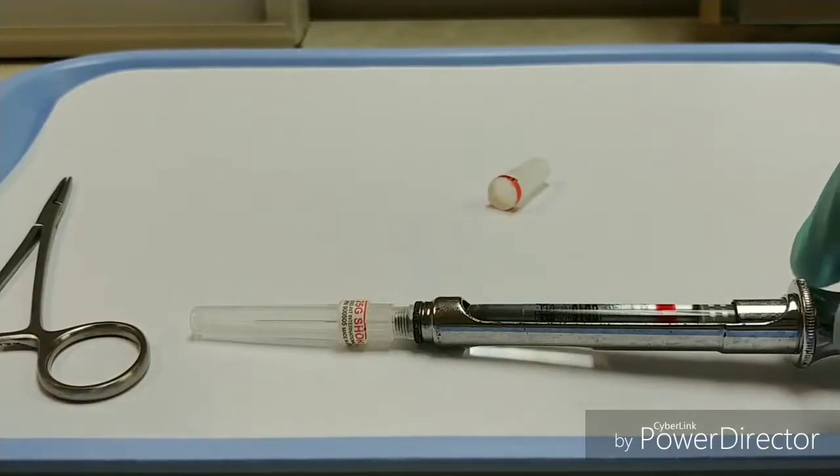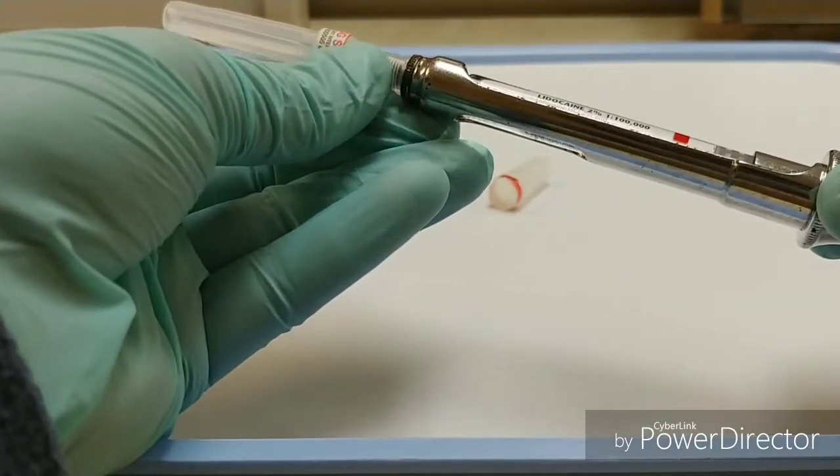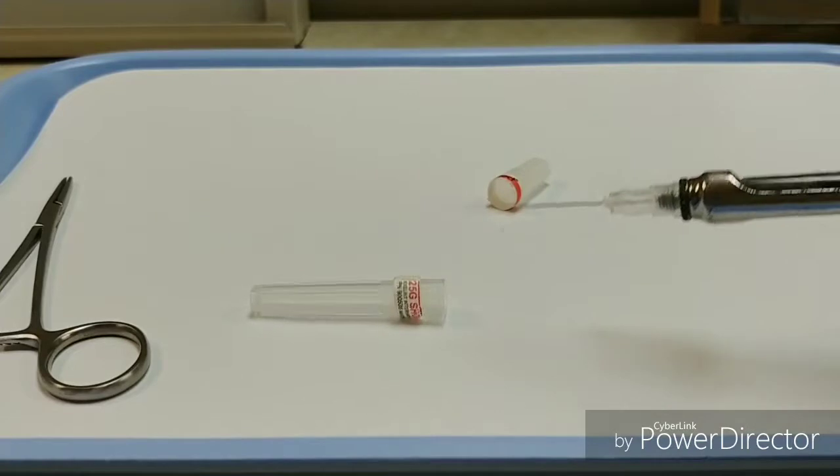To safely uncap your needle, you can grab the cap near the hub and just wiggle it a little bit to loosen it, then allow the cap to fall away.